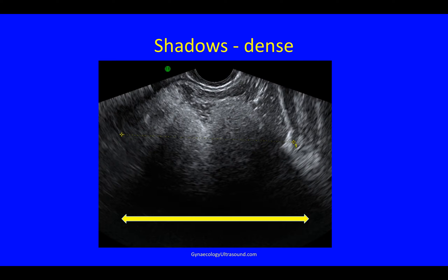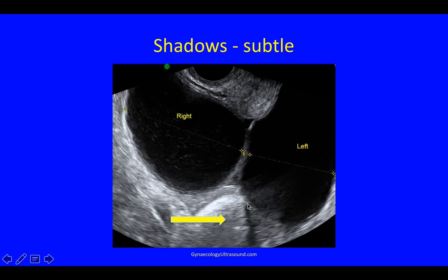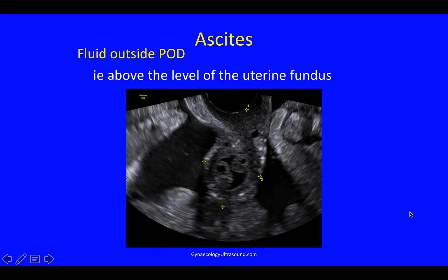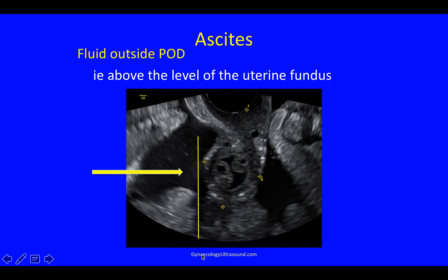We also look for shadowing, and you have to actively look for this. This is dense shadowing behind a mass, but you can also find very fine shadowing behind a mass. Ascites is described as fluid outside of the pouch of Douglas. In a longitudinal view, this is the pouch of Douglas, and you can see that if you draw a line at the fundus of the uterus, there is fluid above it — so this is ascites.